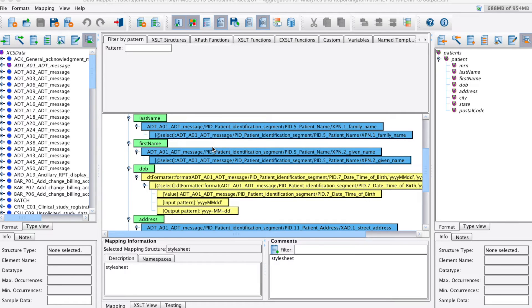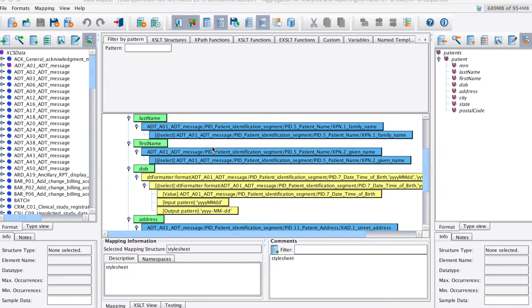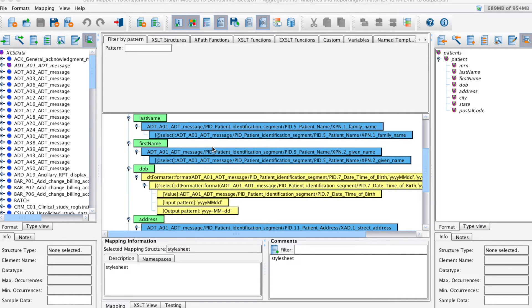We can also see a yellow note underneath the birth date that demonstrates how the EI console's data mapper can be used to perform data manipulation during the mapping process. Here we're formatting the date of birth value coming in from our HL7, in an XML date format using our date formatting tool from the palette above.